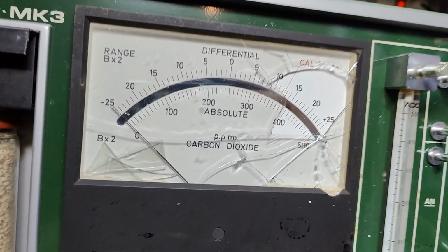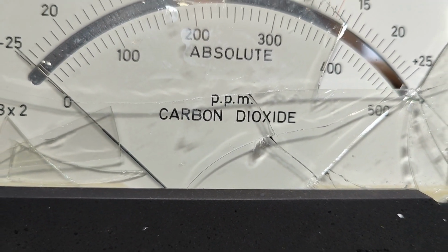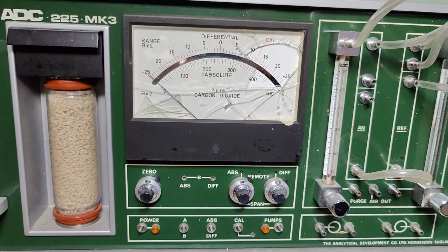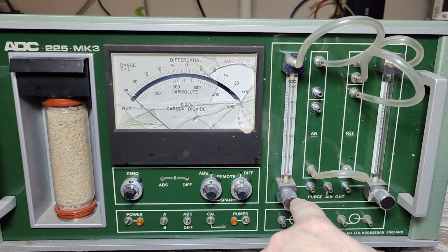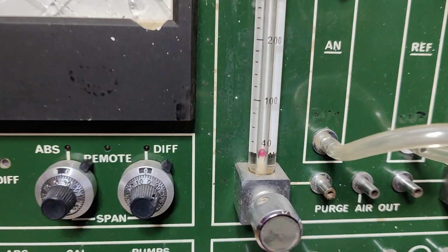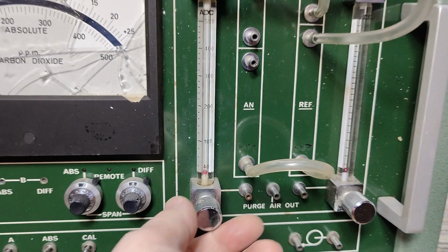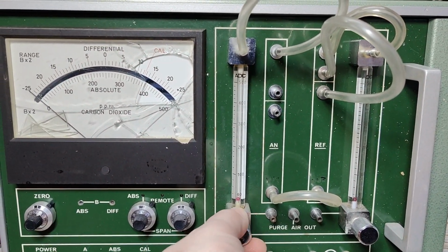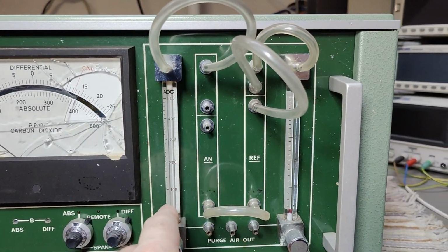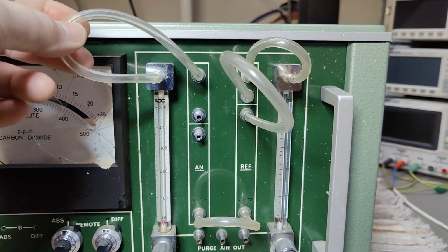It says here on the meter, it's a carbon dioxide measurement system. So I think we got some different flows. So that would be a flow meter. See, there's a tiny little ball down there that goes up when the flow pushes it up. And then you can open and close the valve here to adjust for the wanted flow. And we got two of these. And you can connect things a little bit differently.